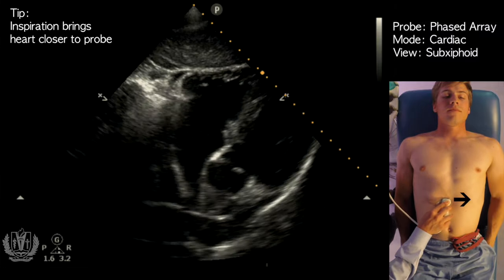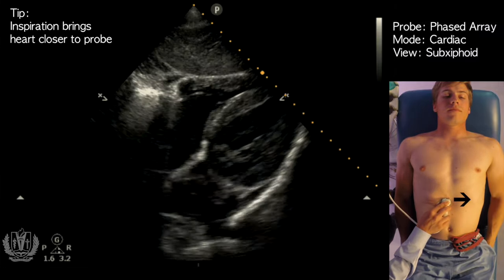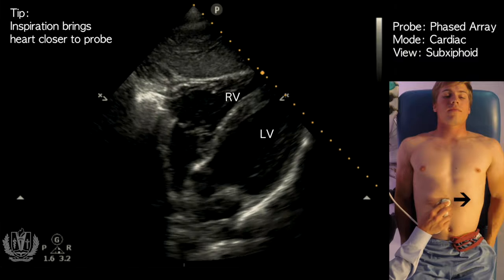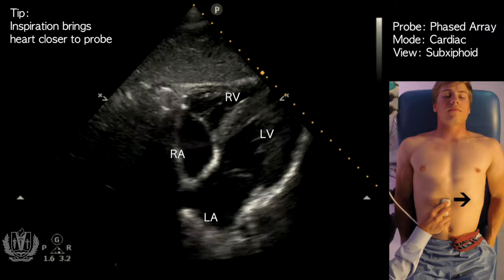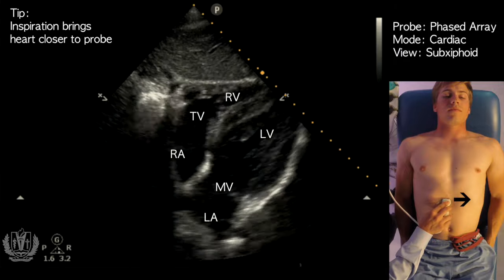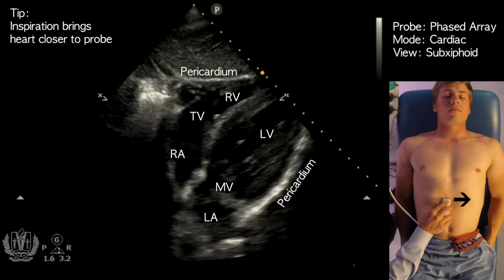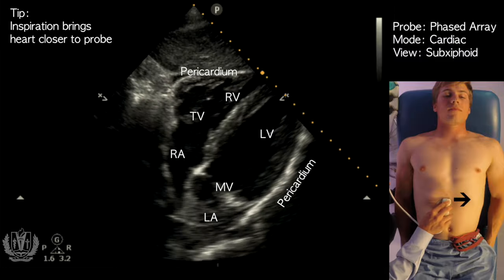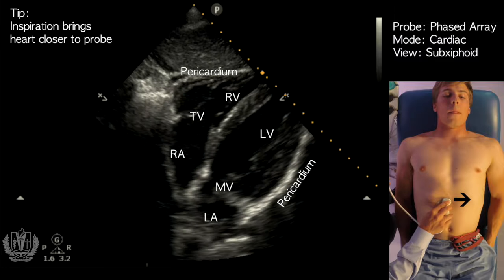As the patient inspires, you can see the four chambers of the heart: the right ventricle, left ventricle, right atrium, and left atrium, as well as the tricuspid and mitral valves. This view also allows you to see the pericardium, and it's a great view to look for pericardial effusion and tamponade, as well as for comparison of ventricular sizes.